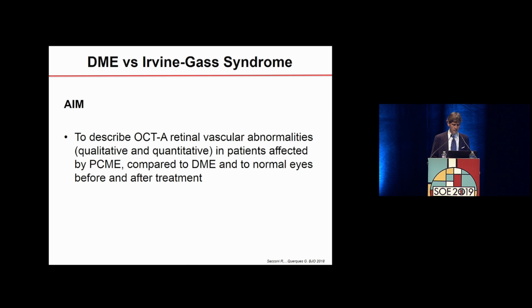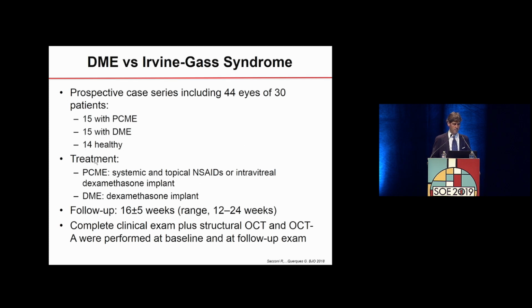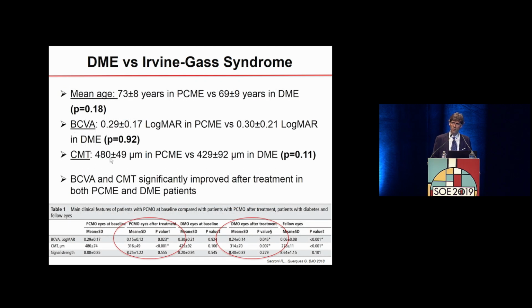Then we, and this is the last topic of my talk, we tried to investigate if all edema are the same. And we looked at diabetic macular edema versus post-surgical edema by means of OCT-A, of course. So we had two different populations with edema and a control group. And the patients were then treated, and we looked at the outcomes of treatment.